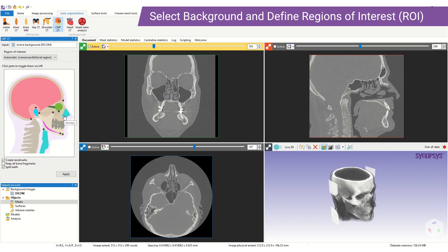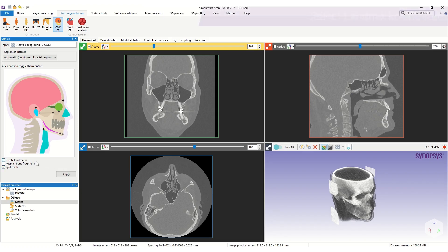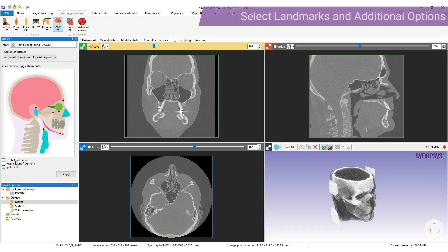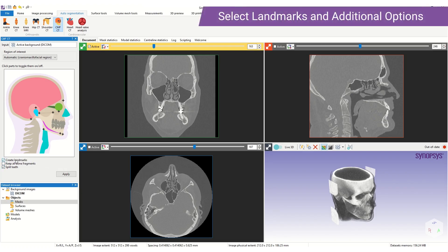One great aspect of our auto segmenters is the automatic positioning of anatomical landmarks. We have the option to toggle that off and on here. Additionally we can specify the keep all bone fragments option, which is useful in fracture cases. We also have an automatic split teeth operation which subdivides the teeth into upper and lower, and incisors, canines and molars.